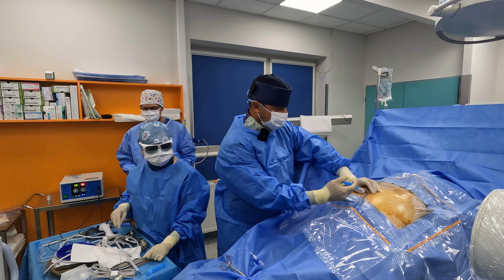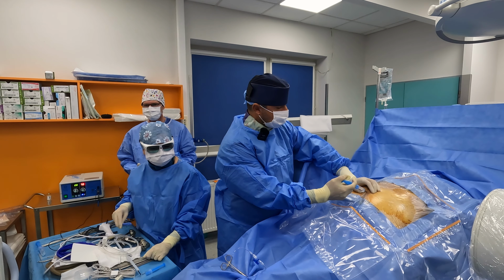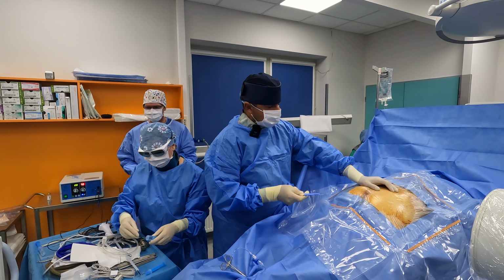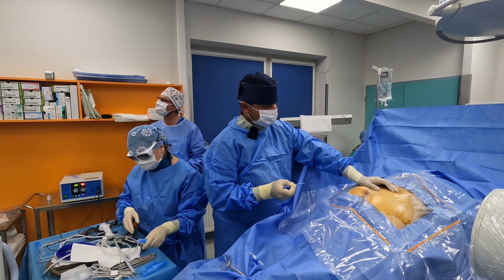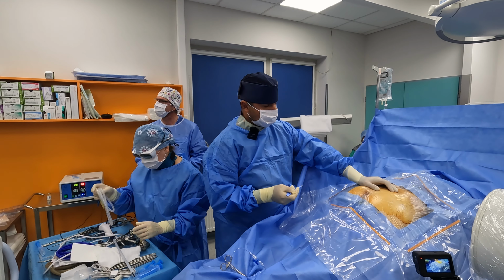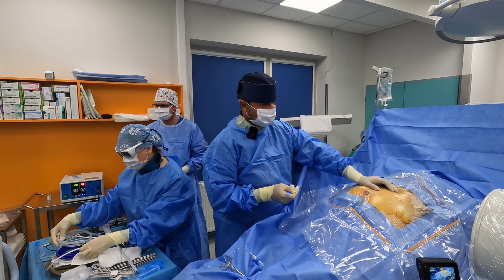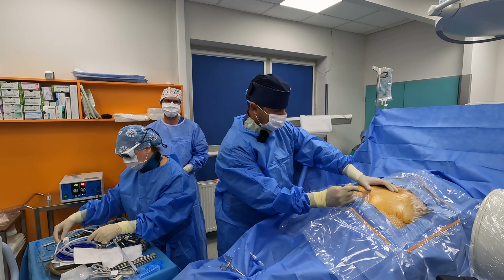So this is the first step. You inject local anesthesia. The patient is awake. It's the best neuromonitoring. The second step, and this is a little bit unusual for a pain physician from time to time, you can use the Seldinger technique. That is one option, but the epiduroscope we are using today is without the Seldinger technique. So what I'm doing is a surgical technique instead.